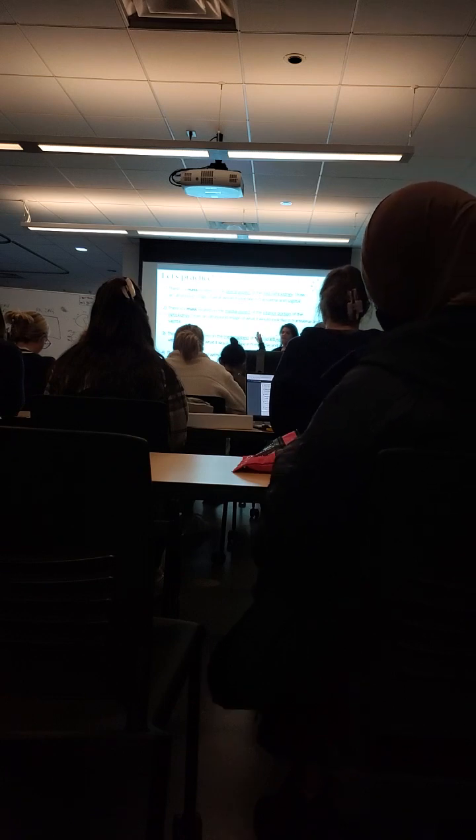We're going to do number 2 together. There's a mass located, where are we at? Right kidney. So let's put right kidney, and then transverse, and then right kidney sag. Everybody do that. This is number 2. Okay, we're going to dissect this slowly. There's a mass located on the medial aspect.